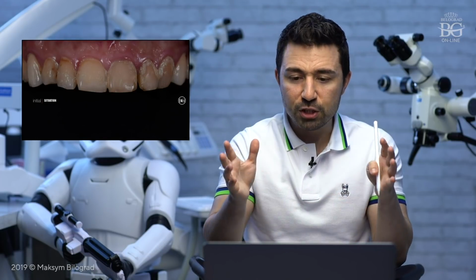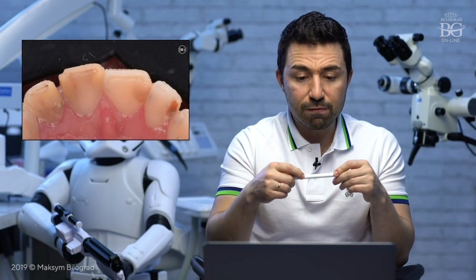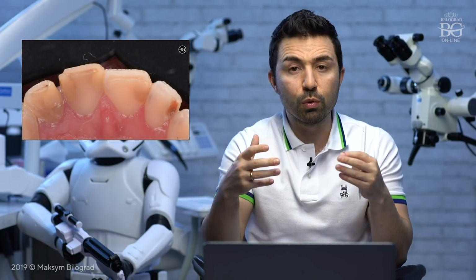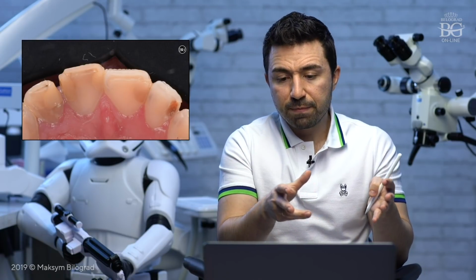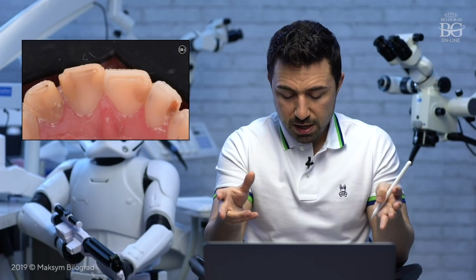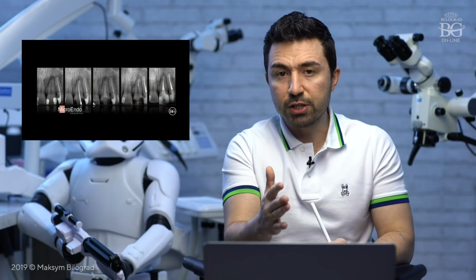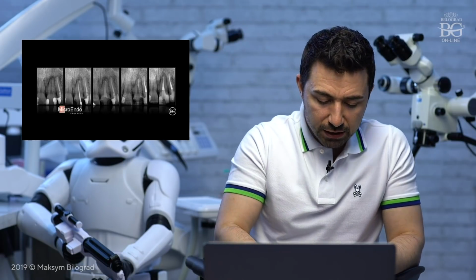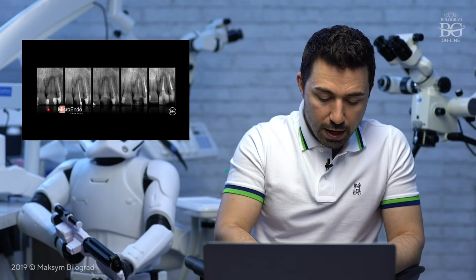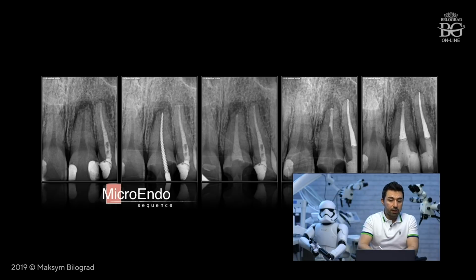Okay, so let's go. This is another view of those teeth. From the palatal side, you may see multiple composite fillings and caries defects, and here is our step-by-step endodontic approach. As you may see, the central incisor is necrotic, so that will be primary endo. In this case, we decided to go for two-step endodontic treatment.